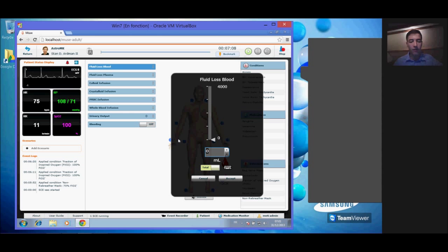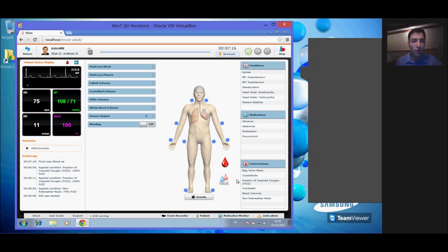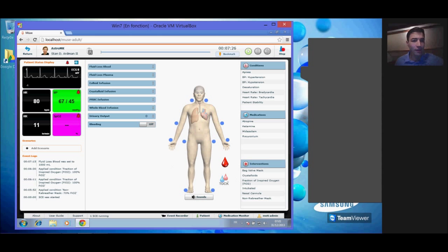I suggest you give 1 liter. You see the blood pressure will drop really badly, and it's going to start beeping, and you can hear it.